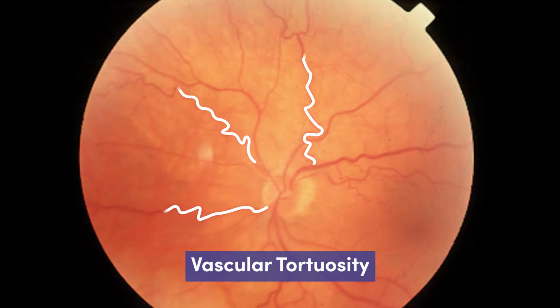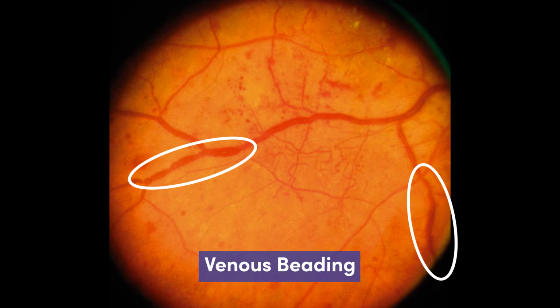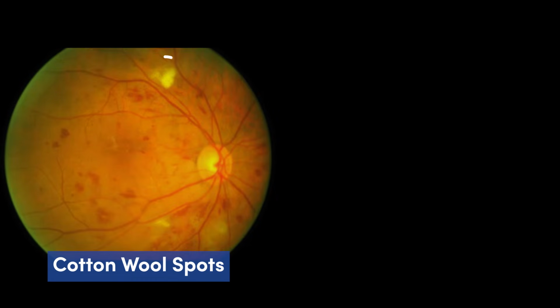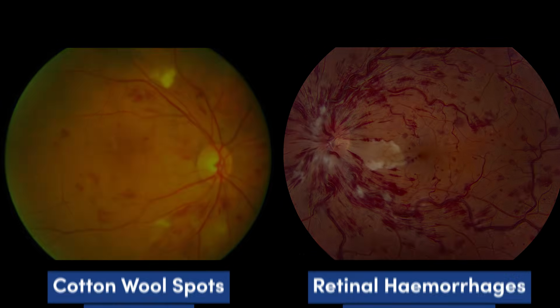Look for abnormalities such as vessel tortuosity and AV nipping, seen in systemic hypertension, and venous beading, which is seen in severe diabetic retinopathy. Also look for perivascular abnormalities such as cotton wool spots and retinal hemorrhages, which are seen in conditions that include diabetic retinopathy and retinal vein occlusions.